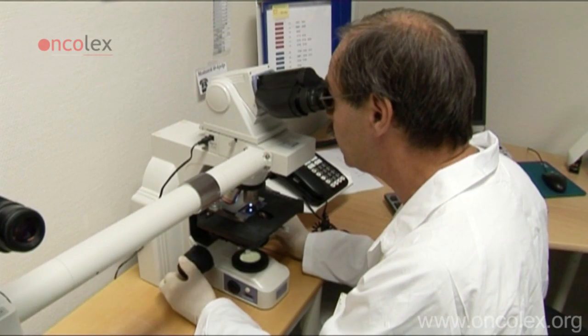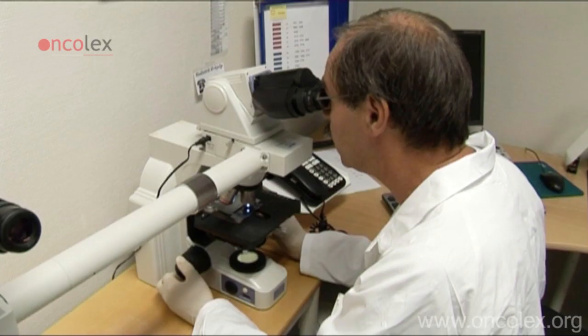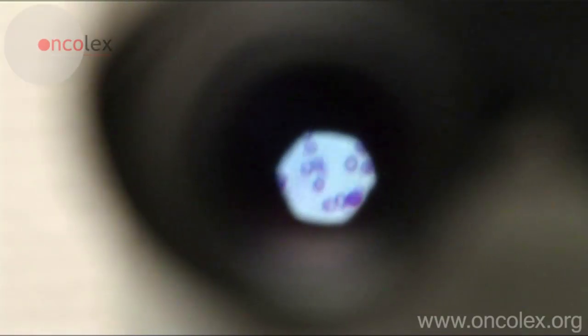The specimen is examined under a microscope with a 10 or 20 magnification lens immediately after staining.